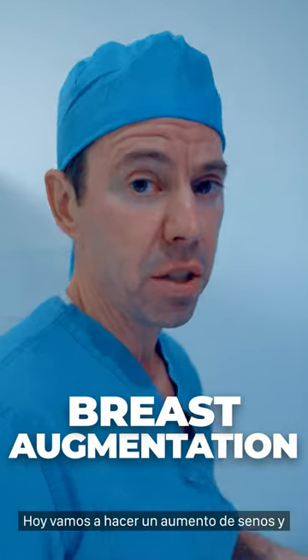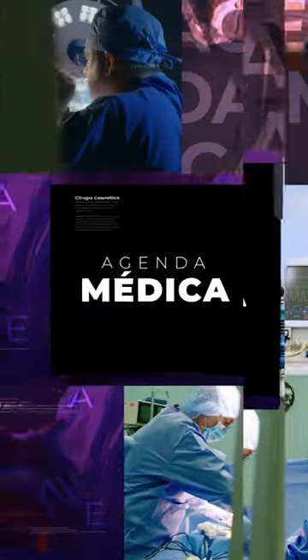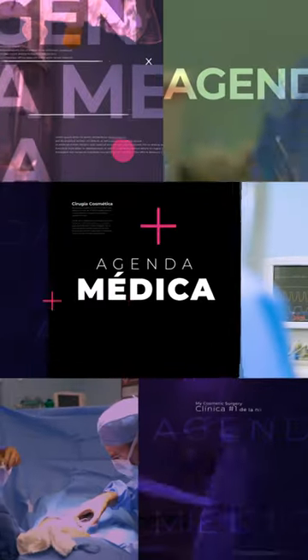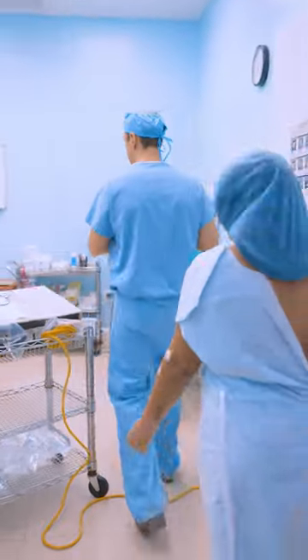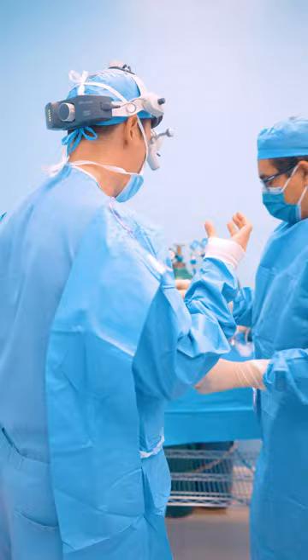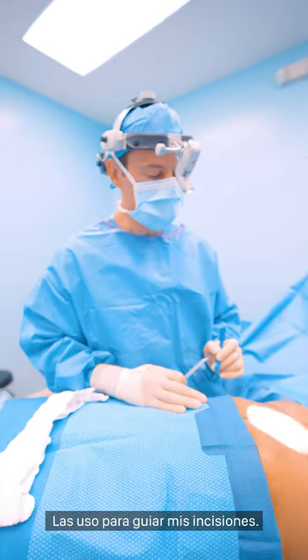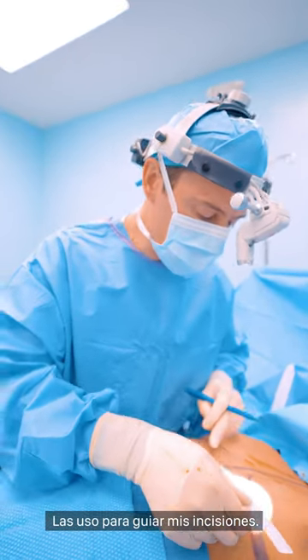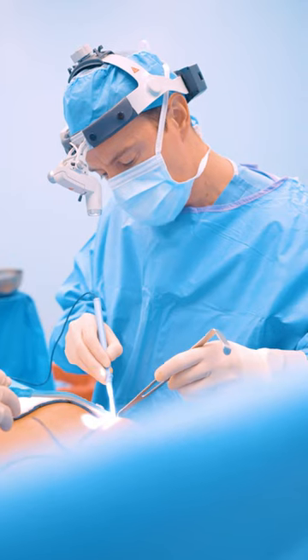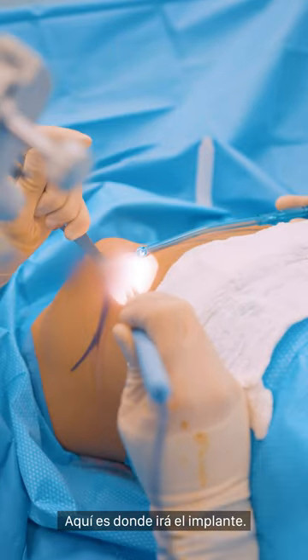Today we're going to do a breast augmentation. The implant is going to go underneath the muscle. These are my preoperative marks, and I use these to define where I'm going to make my incision. And this is where the implant will go.